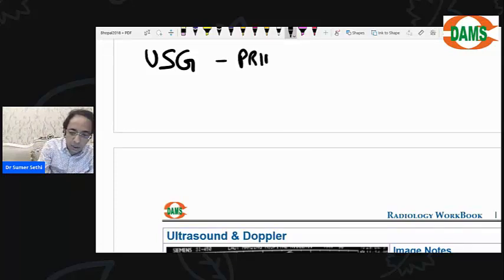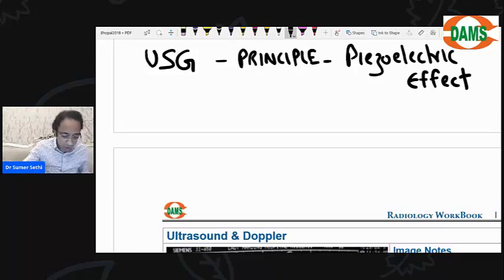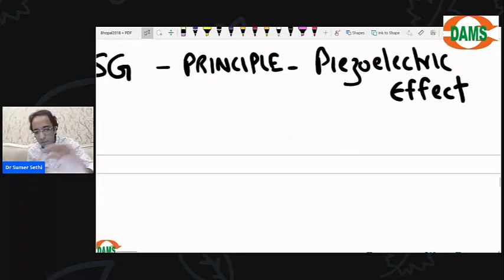Ultrasound is based on a principle called the piezoelectric effect. Any one of you can see this question in your exams. Ultrasound is based on a principle called, I'm going slow, piezoelectric effect.